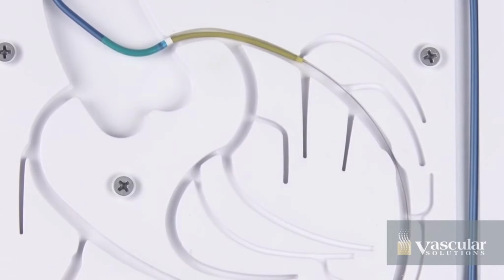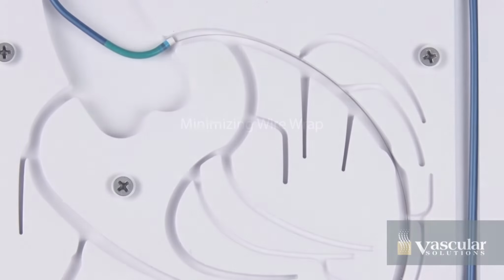After completing the procedure, remove the GuideLiner catheter prior to removing the guide catheter from the vessel.